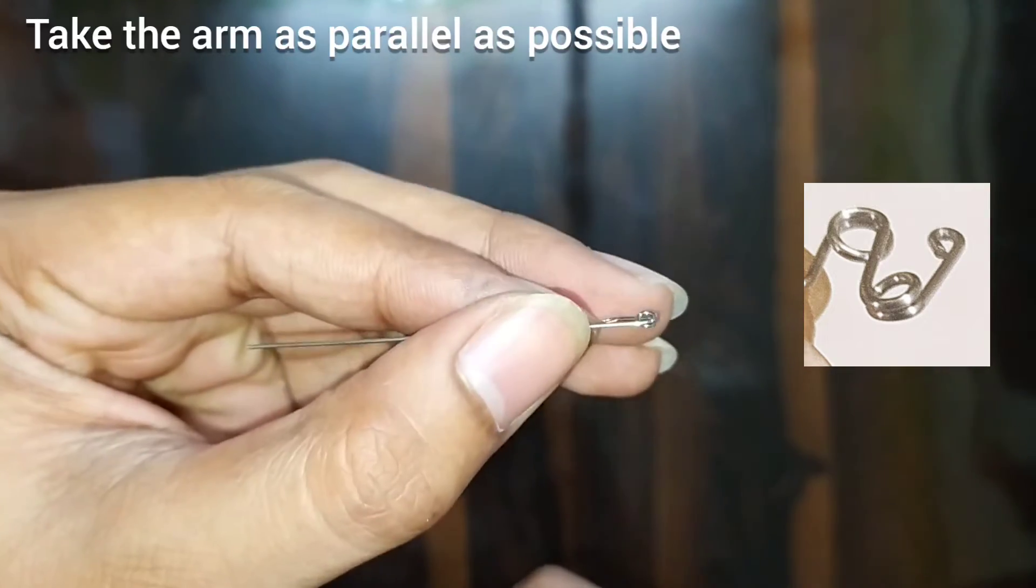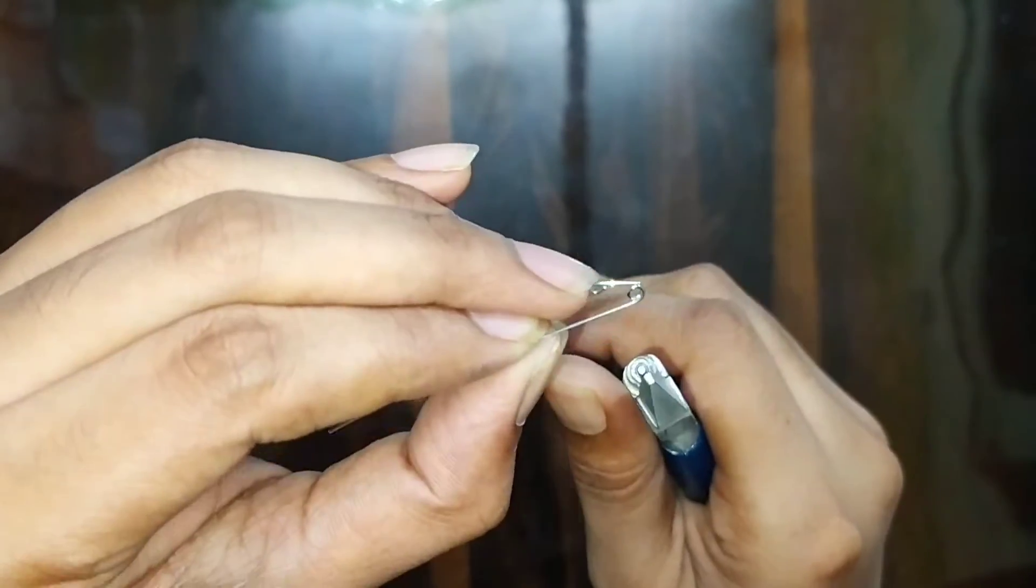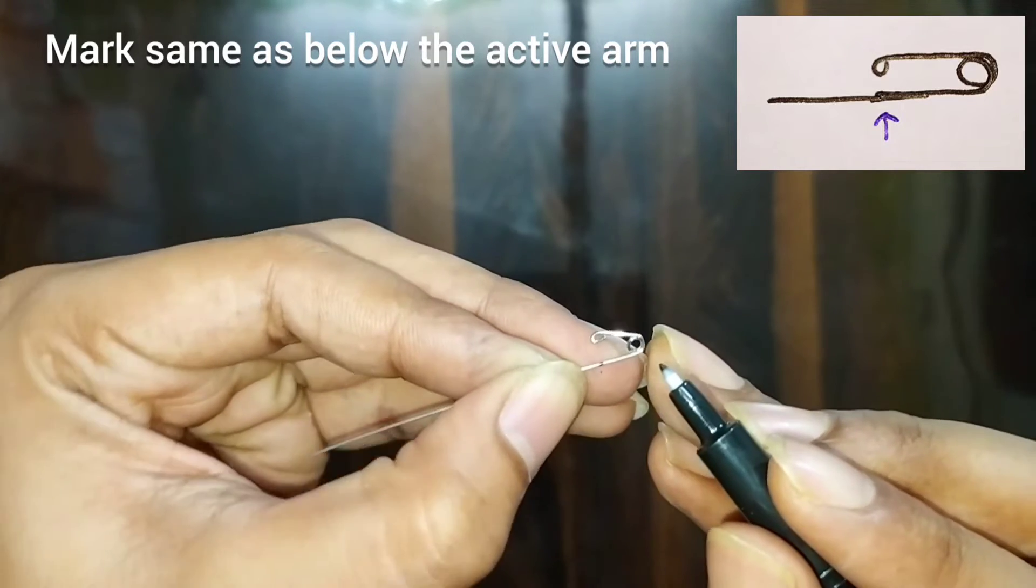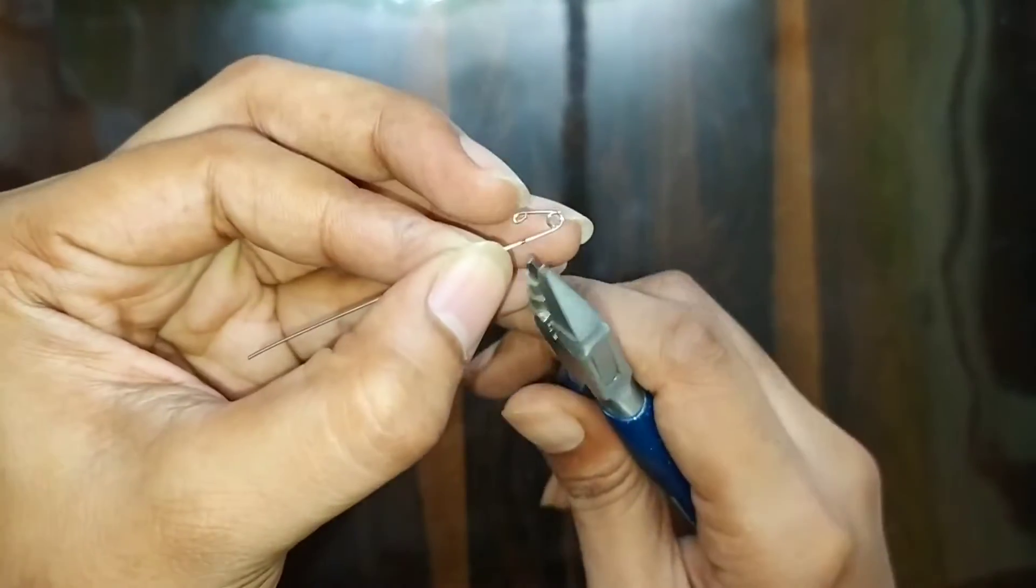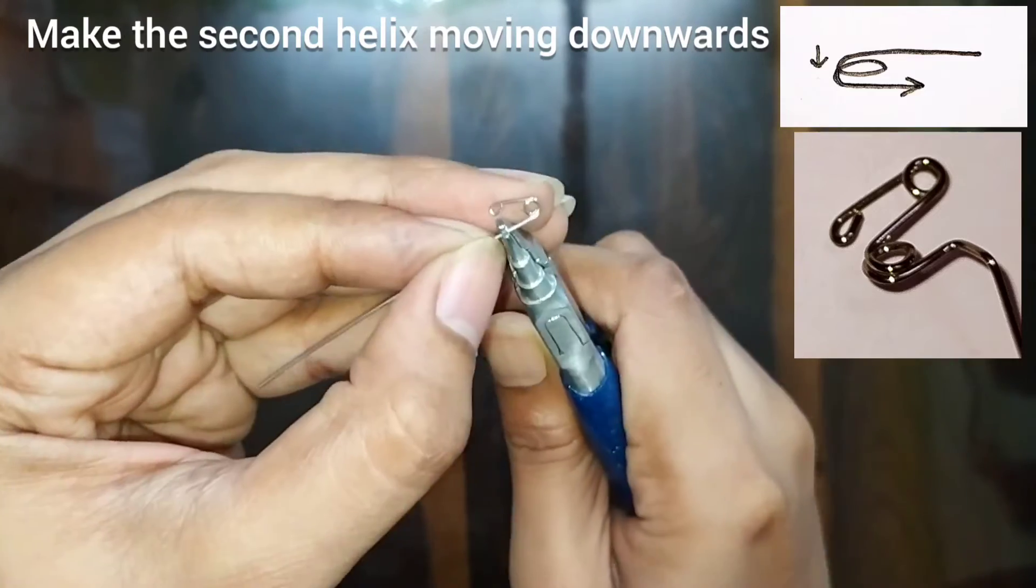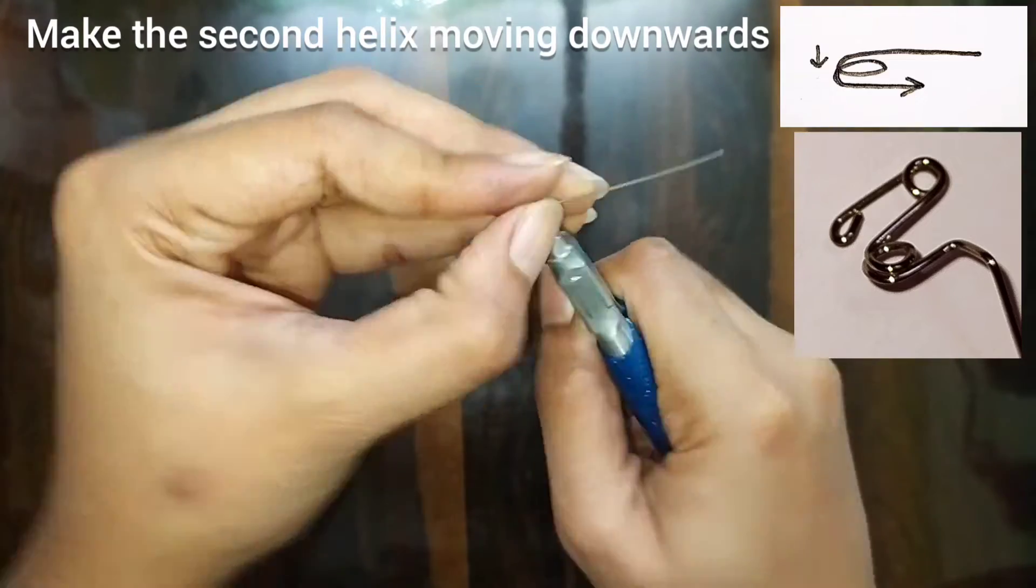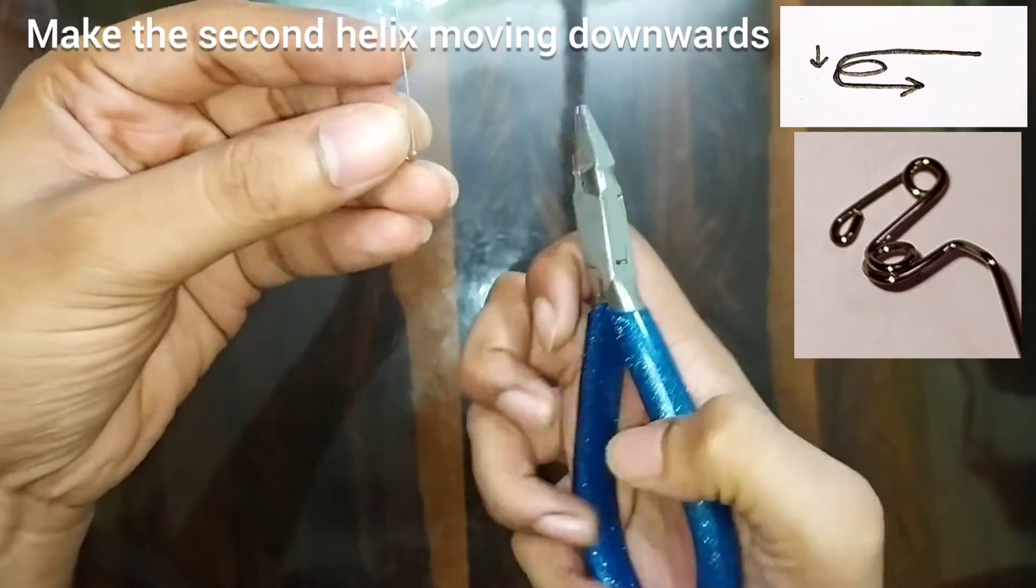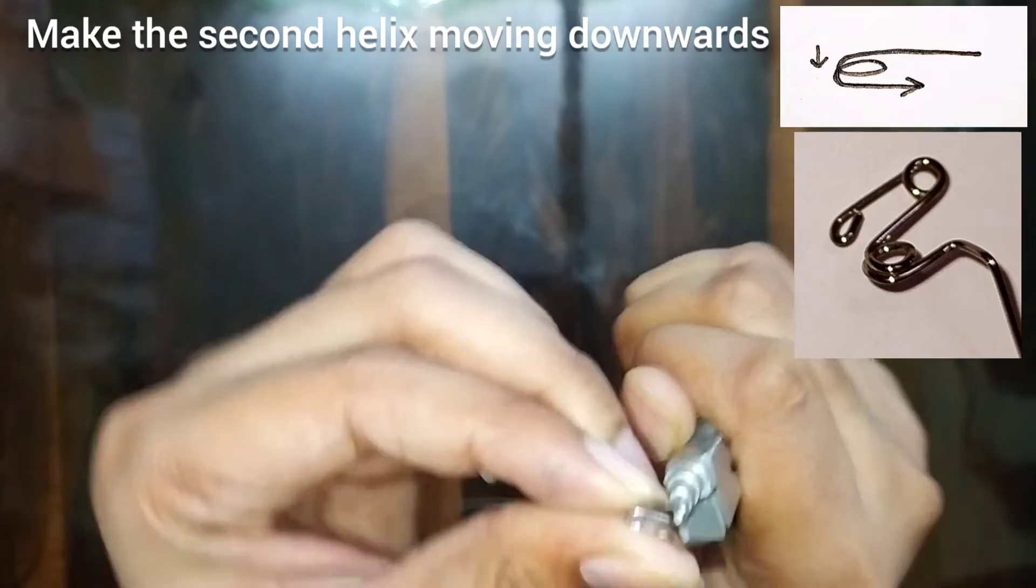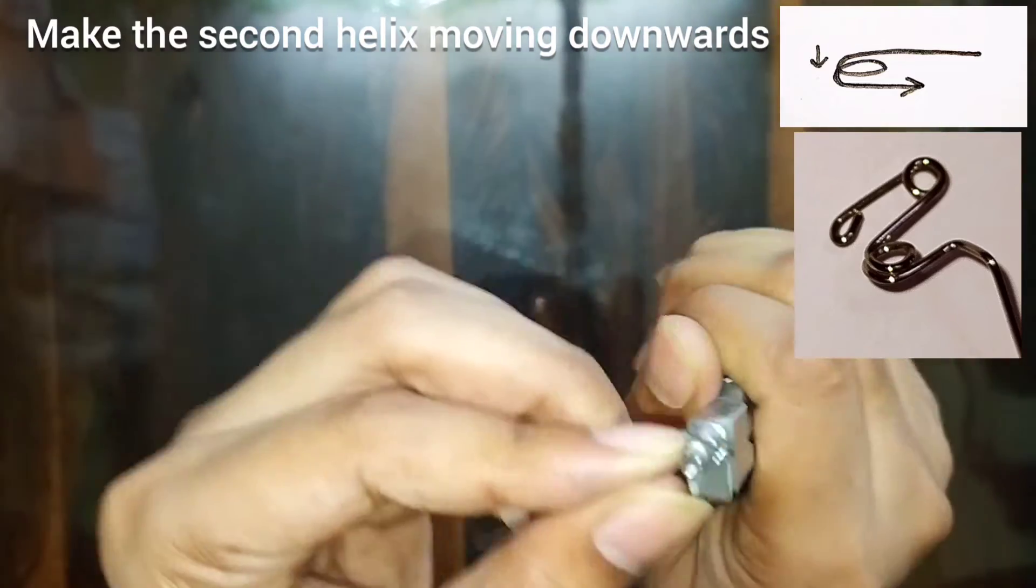In this way it should look. Again we will do the marking exactly below the tag for the second helix. This time the turn should be downwards, below the active arm. You can see in the figure. Hold the wire at the tip of the plier and try to give as small as possible the helix.